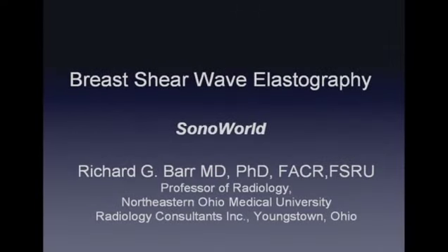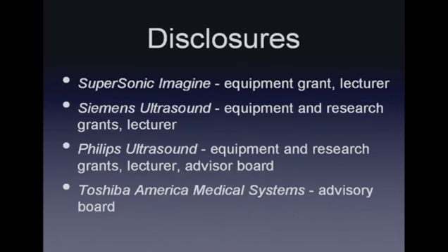Today I'd like to give an update on our work on shear wave elastography of the breast. This is to follow up the other lectures that we have on SonoWorld. I do have some disclosures that I work for several companies, as here.